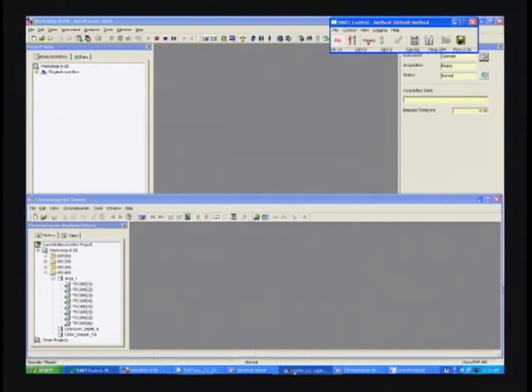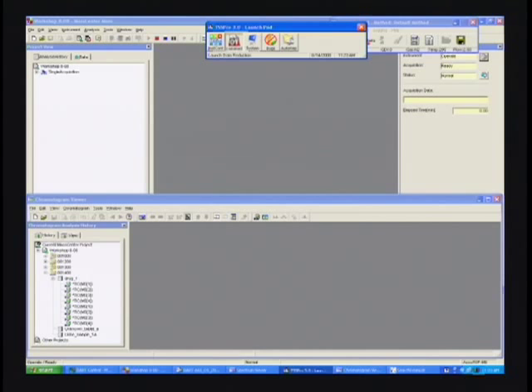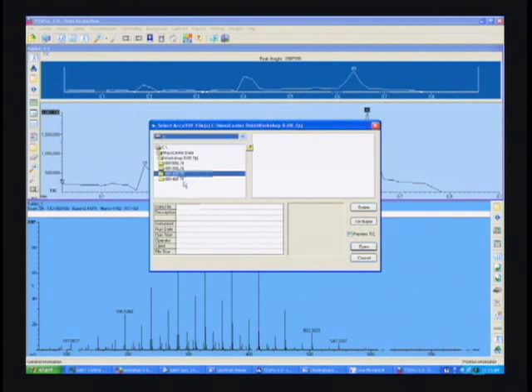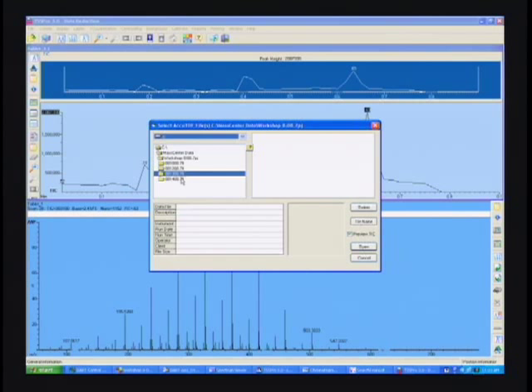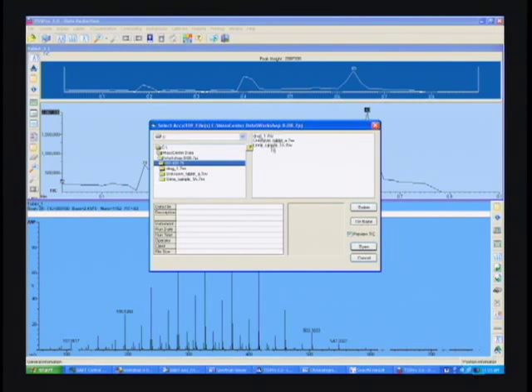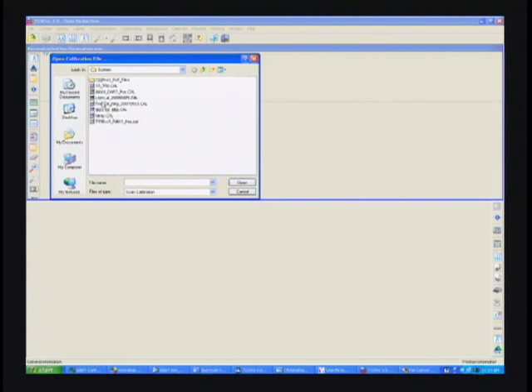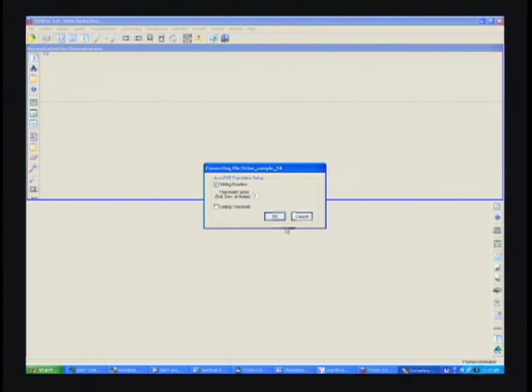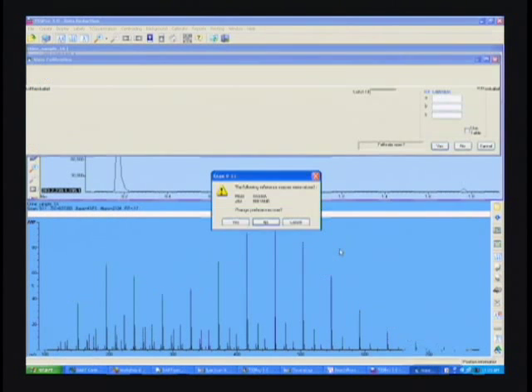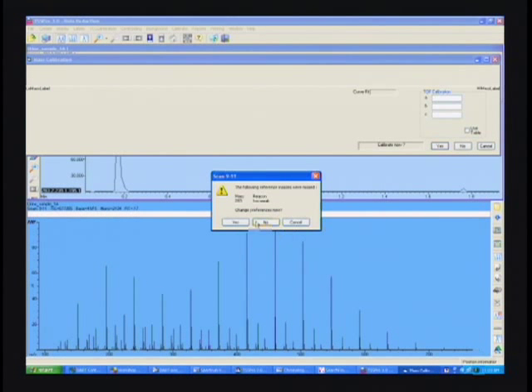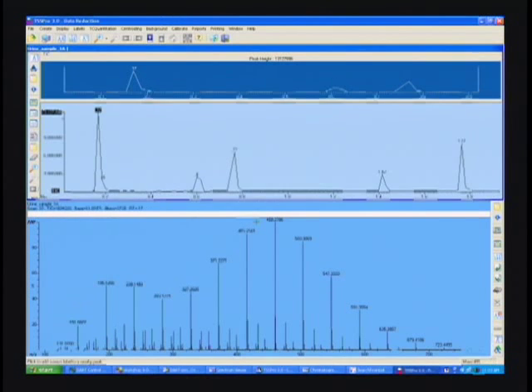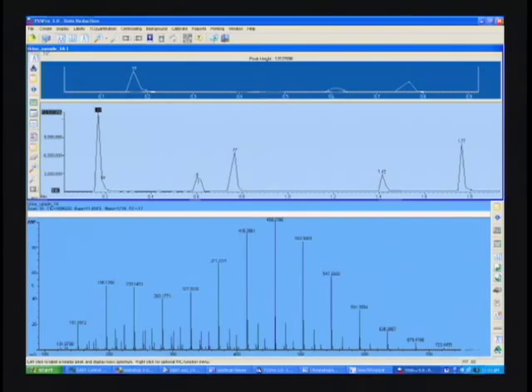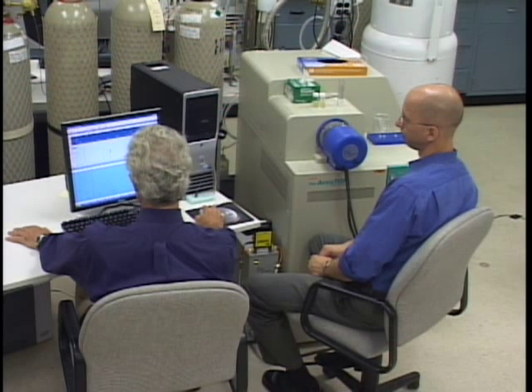We'll open up the data processing program and open up the data file. Start with our default calibration, default parameters. Now with this software, it's handling the calibration in an automated fashion, and everything should be calibrated. Which is a heck of a lot easier in comparison to what you've seen with the last couple of demonstrations in Mass Center.